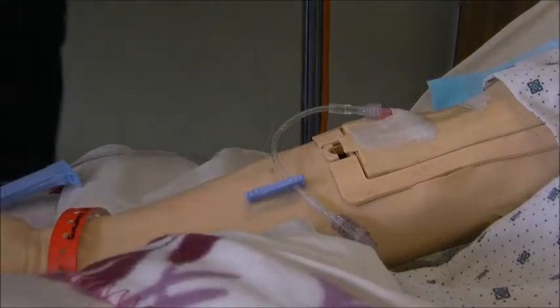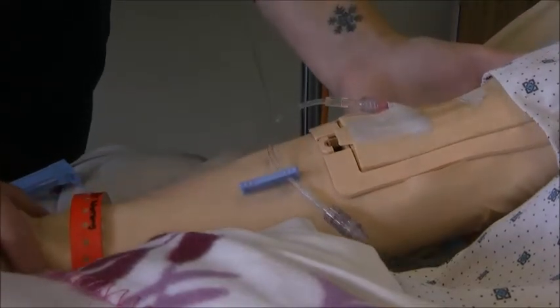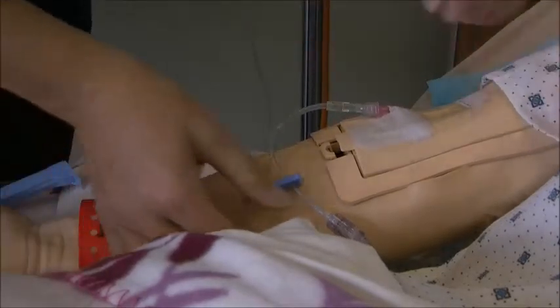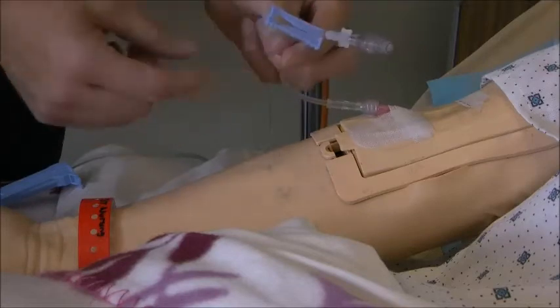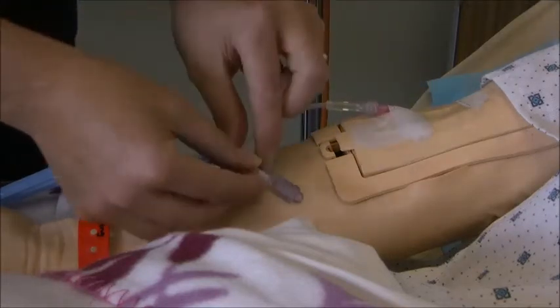Okay, I just want to give you a really good look at the IV itself and what you need to do to connect it up to the IV. So you're looking at the IV that has a dressing over top of it, and it has this extension tubing which has an interlink end on it. This is a clamp that will stop it leaking while it's got nothing attached to it.